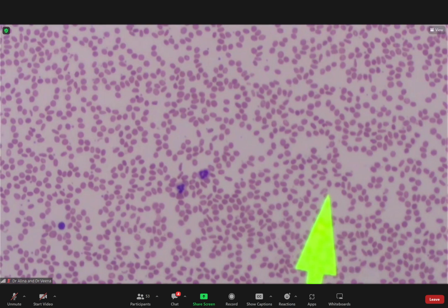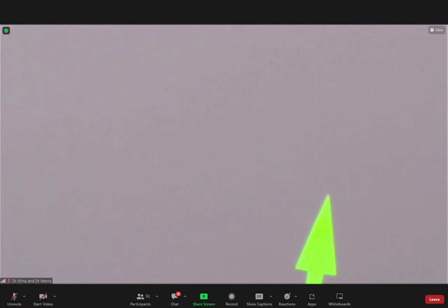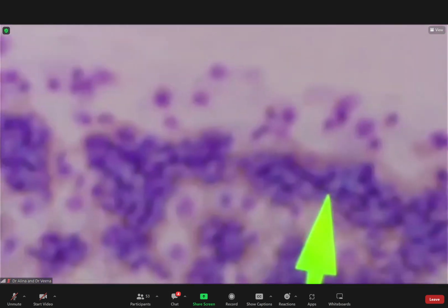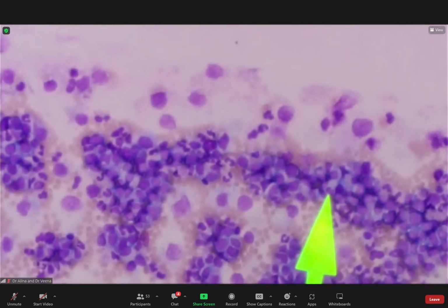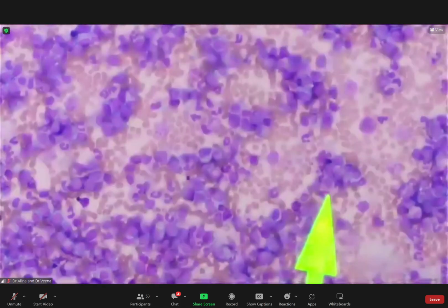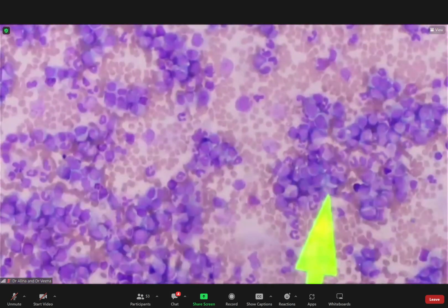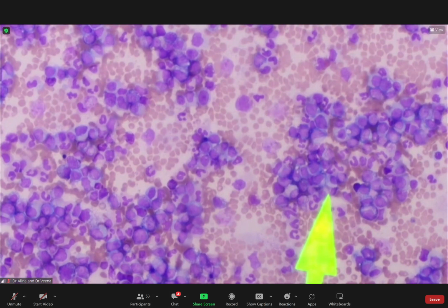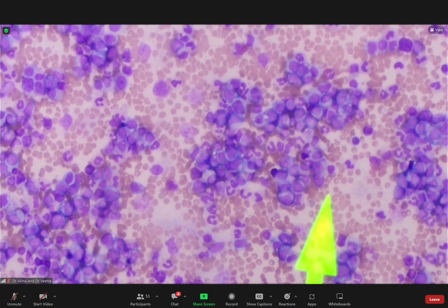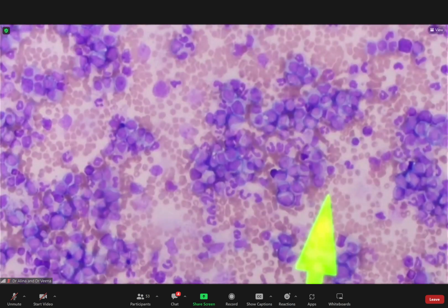All right. So now we go to question 5. Right, so this is an obvious case. Again, like I said, there were people who didn't write hyperleukocytosis when clearly this is a case of hyperleukocytosis, right? That's the most prominent feature here, full of white cells. And yet there were still participants that didn't write hyperleukocytosis. When you write hyperleukocytosis, that's already half a mark. Easy marks.